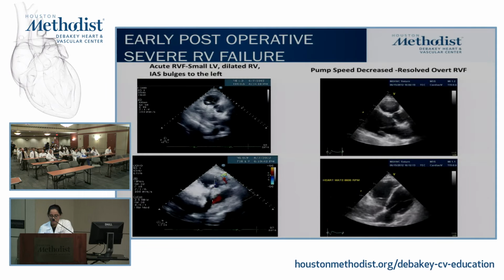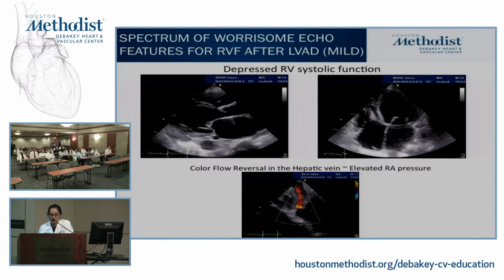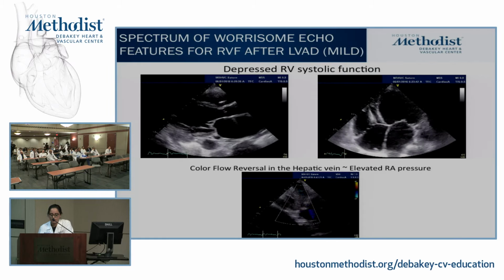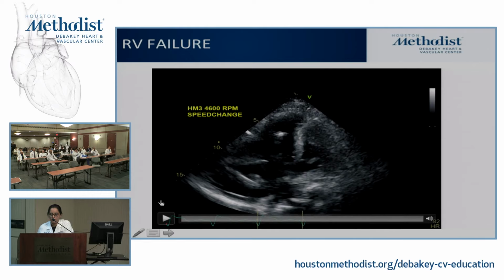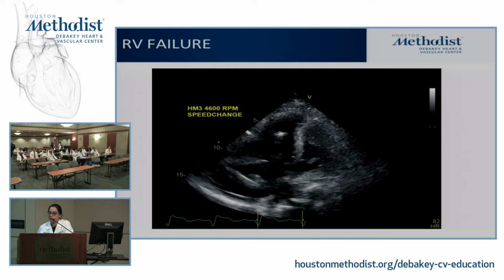They have no control over it, because they put the cannula in, and once they close the chest, the complete position changes. Even if I was trying to be innovative and tell them where to put the cannula by looking at pre-op CT scans and doing mapping for them, it never, so far. Yeah, once the chest closes.